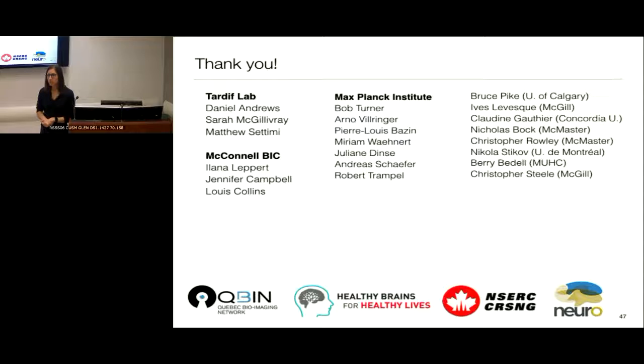I'd say the real problem is when you're going for resolution, because then your scan time for a single image just gets longer. And there's a lot of work being done in that field using either cameras, so cameras that are mounted in the bore, or sensors. And what's nice is that it's kind of tied into the image acquisition.